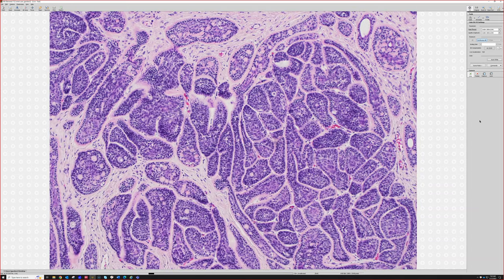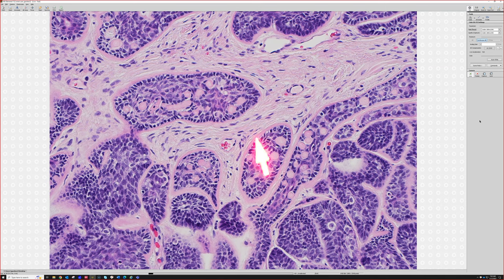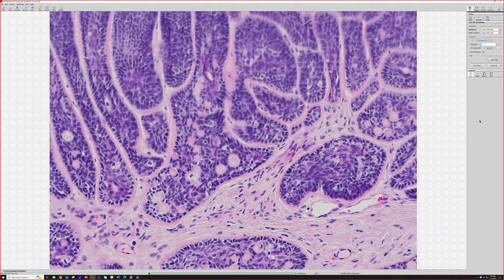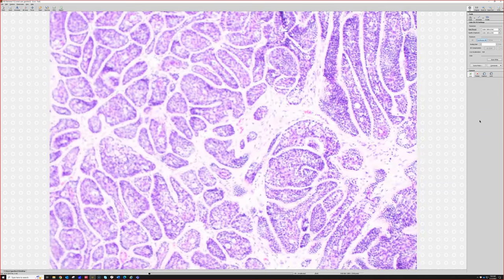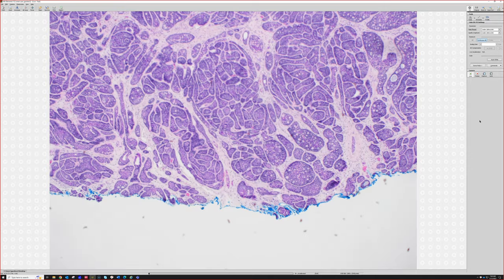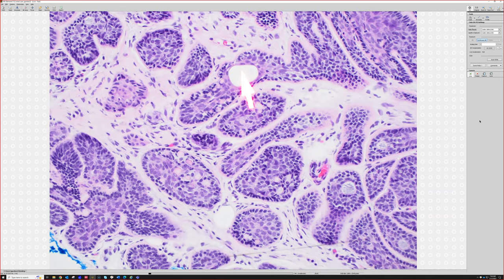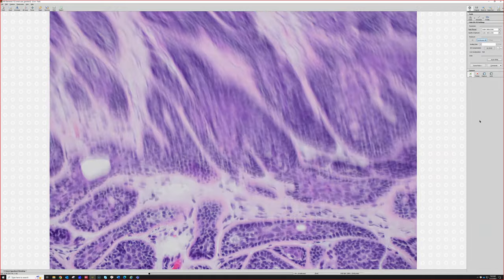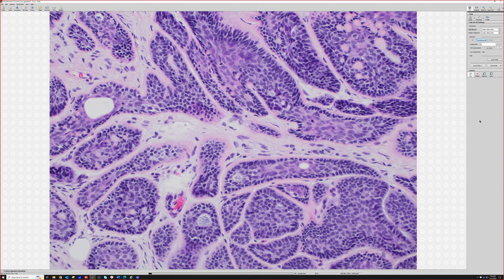They often have a dense layer of basement membrane, collagen type 4, surrounding the outside of the nests, like a thick pink layer. And that layer is often squished between the nodules. And then they tend to have these little droplets of basement membrane that are these little round spherules of basement membrane in the midst of the nests too. Okay, and then don't be surprised if you find some areas that look like spiradenoma in the tumor, because that's often present. And then you'll see a variable amount of sweat ducts. See, here's a sweat duct right here. But honestly, this is such a recognizable tumor once you know what it is that you don't even need to go looking for the ducts. You see it from low power and you know Cylindroma.